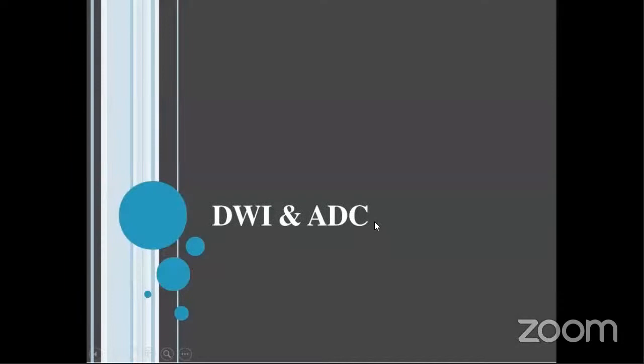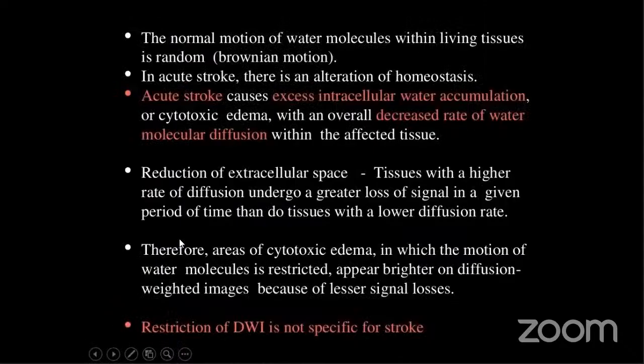So when someone asks you about a gold standard for imaging of stroke, your first answer has to be diffusion weighted imaging. It is the gold standard sequence that you need in stroke. From diffusion weighted imaging only, you acquire an apparent diffusion coefficient. Why am I stressing diffusion weighted images?